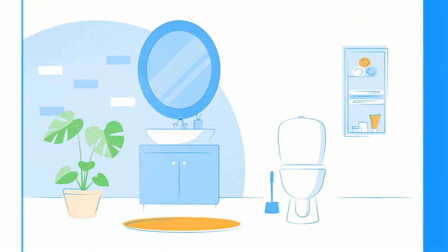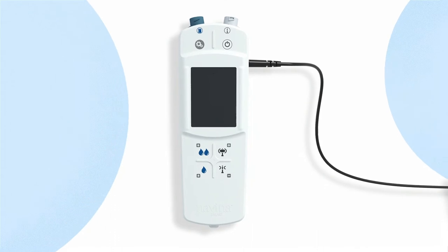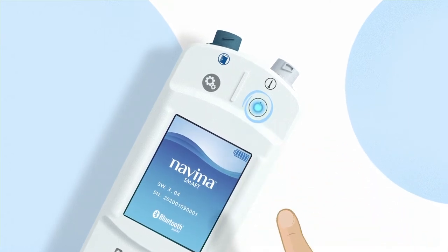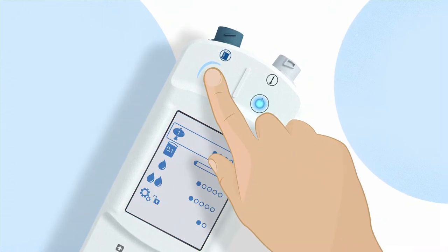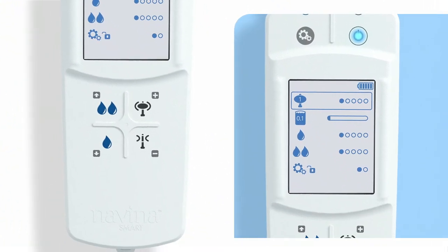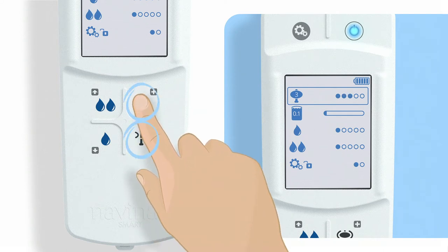Before you get started, you need to do some preparation. Switch on your charged Navina Smart control unit using the power button. First, you need to customize your settings. To do this, press the settings button. This brings you to the setting mode. Right at the top, you find the setting for maximum balloon size. Use the plus and minus buttons to set the size of the inflated balloon, recommended by your healthcare professional.